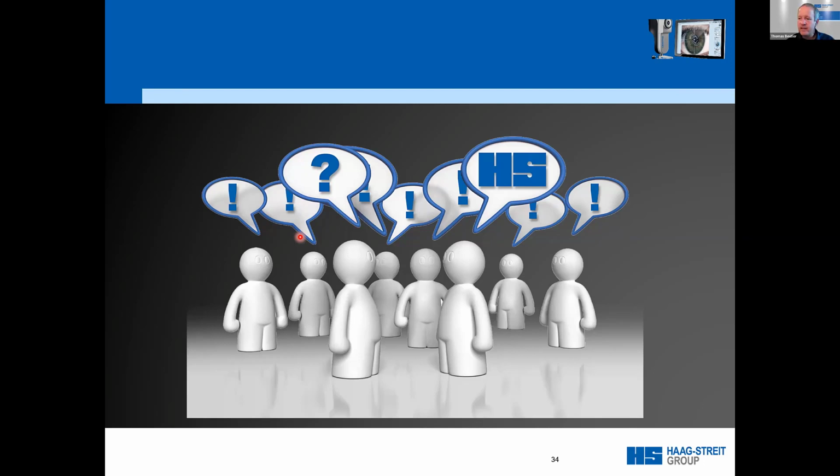Okay. Then another question, you talked about validation criteria. Are there any references which could be downloaded for the surgeons? We have, I think, a validation sheet in different languages. I think it's on our webpage. If not, I can send it to anybody who wants it. Just email me and I will send you these standard deviation recommendations or accepted standard deviations.